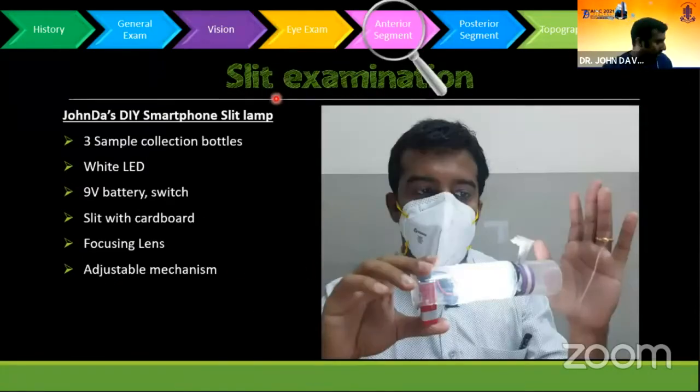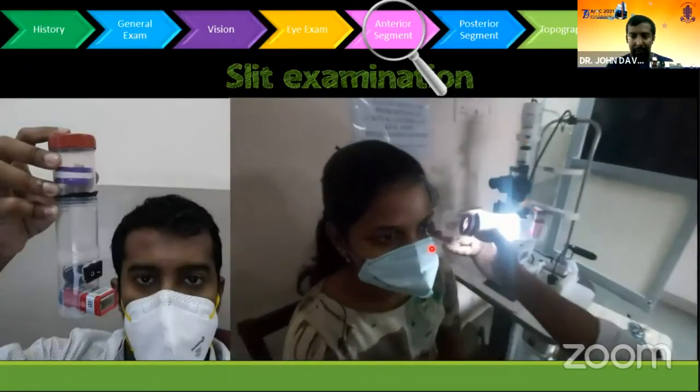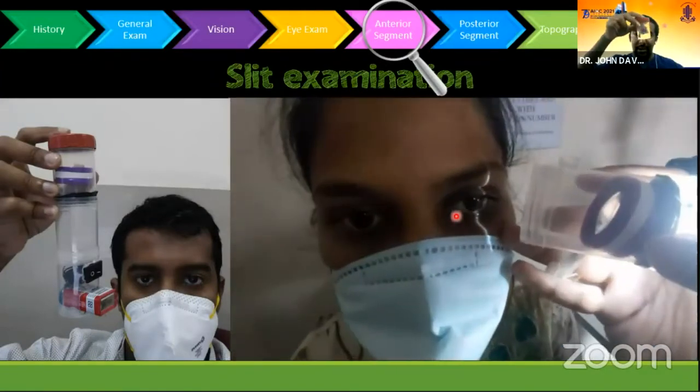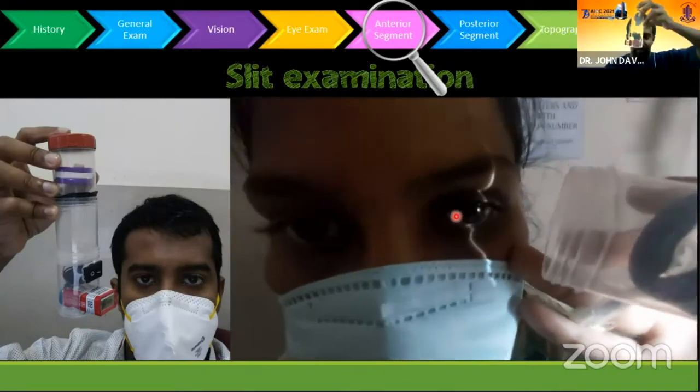This is interesting — just now we saw an innovation with the slit indirect ophthalmoscope. This is a mini version that I made during the lockdown. It is a bright 10-watt LED, a nine-volt battery, a lens, and a slit in between — so you can get a slit for examining the eye. This is a portable slit lamp made out of a urine sample bottle. It is three urine sample bottles, a battery, a switch, and an LED.